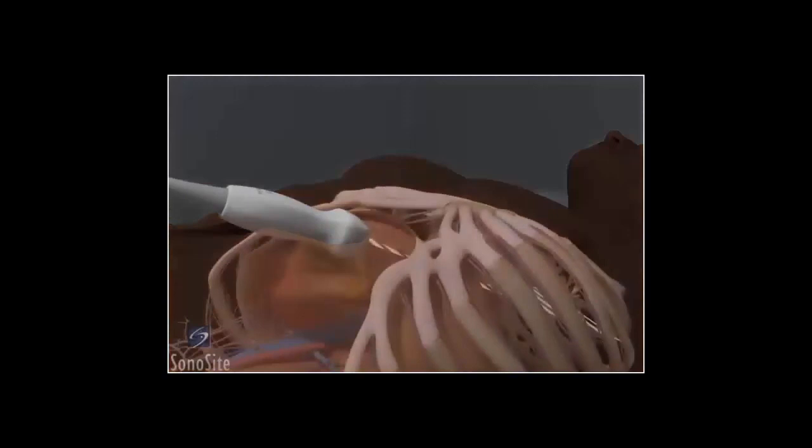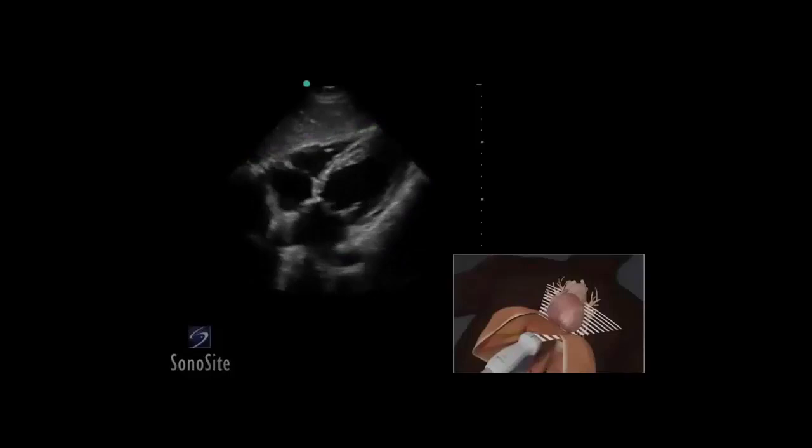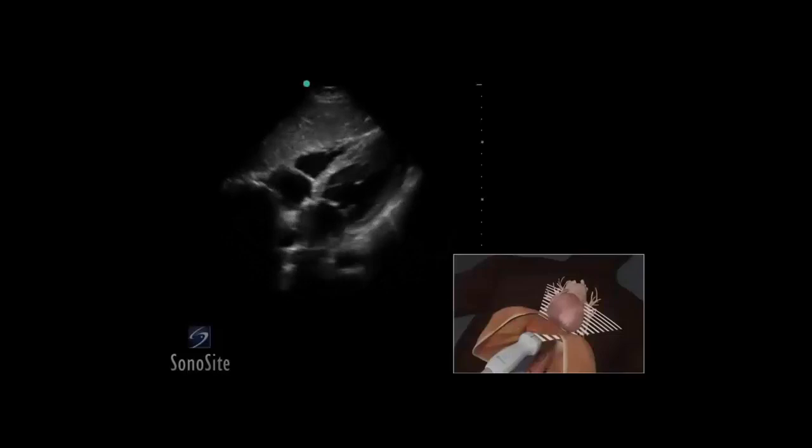Increase scanning depth to visualize all chambers of the heart. The first structure seen closest to the transducer is the liver. The right side of the heart will appear closer to the transducer than the left side on the ultrasound image. The myocardium will appear gray and the blood-filled chambers will appear hypoechoic. The bright white pericardium is seen surrounding the heart adjacent to the gray myocardium. Evaluate the function of all chambers, compare the size of the right and left ventricular cavities, and note any wall motion abnormality and the presence or absence of pericardial effusion.